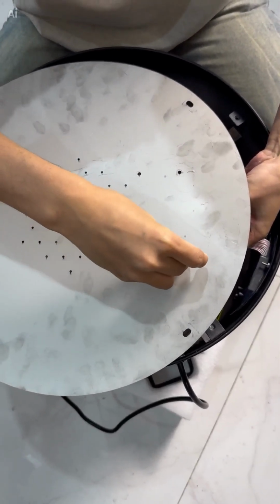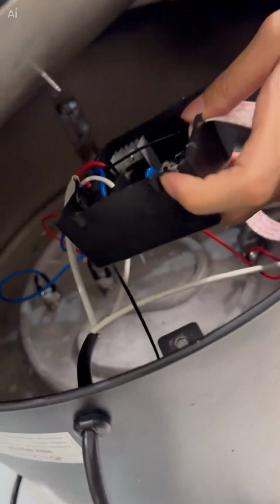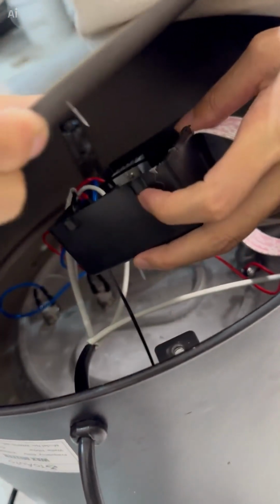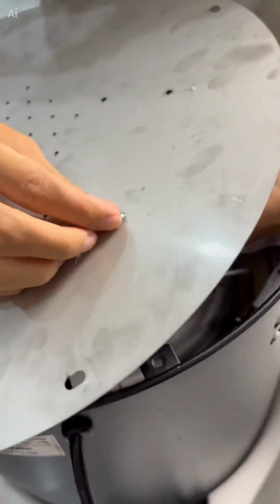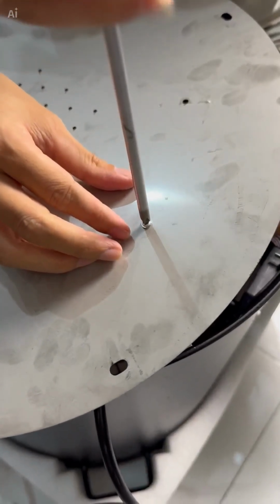First, we insert a screw, then find the right position, align this hole with that hole, and then like this. Come on. Okay, a little more familiar. Good.